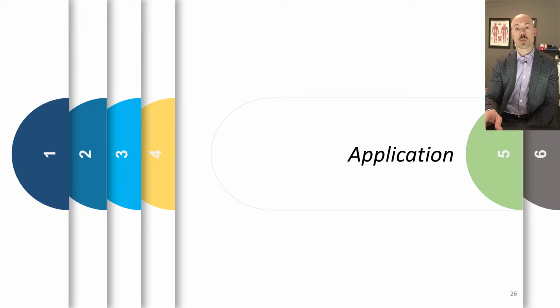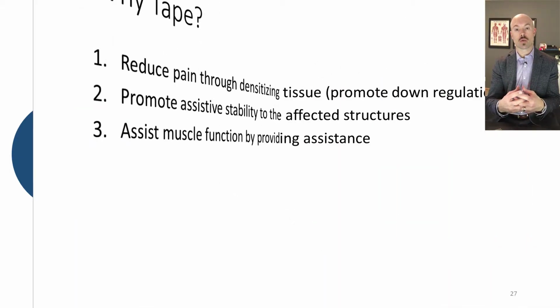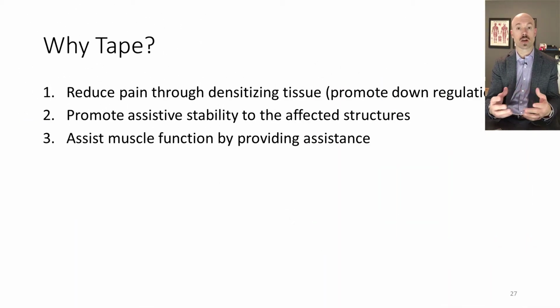So how do we want to apply and how do we want to use tape to our benefit in practice? What are some scenarios that we want to use it for, and what are the reasons for using it? Now, as I had mentioned already, kinesiology tape is used to modulate pain or sensation, and provide better kinesthetic awareness. So there's some kind of neuromodulation. So anytime we have to ask a patient to go through some kind of movement where we're trying to overcome pain or provide better stability, then this would be an opportunity to use kinesiology tape.